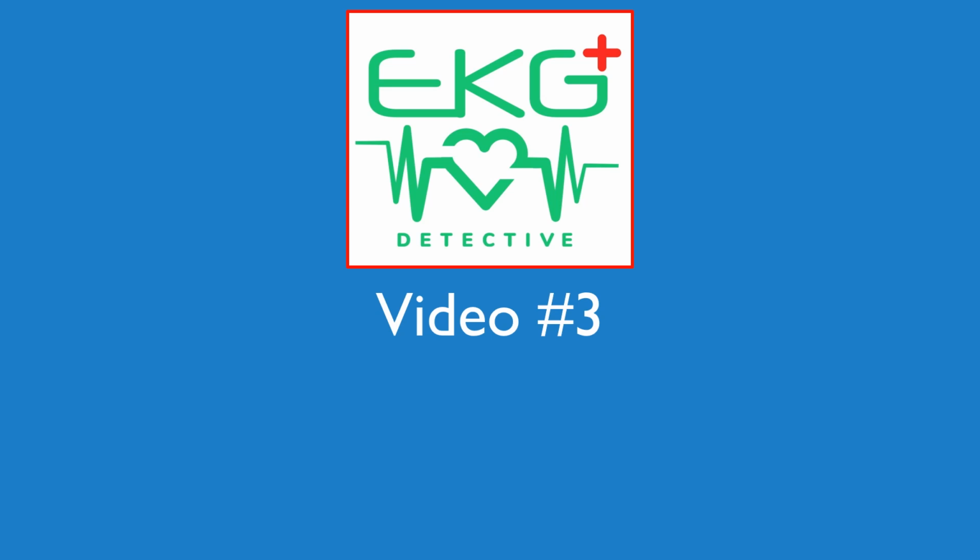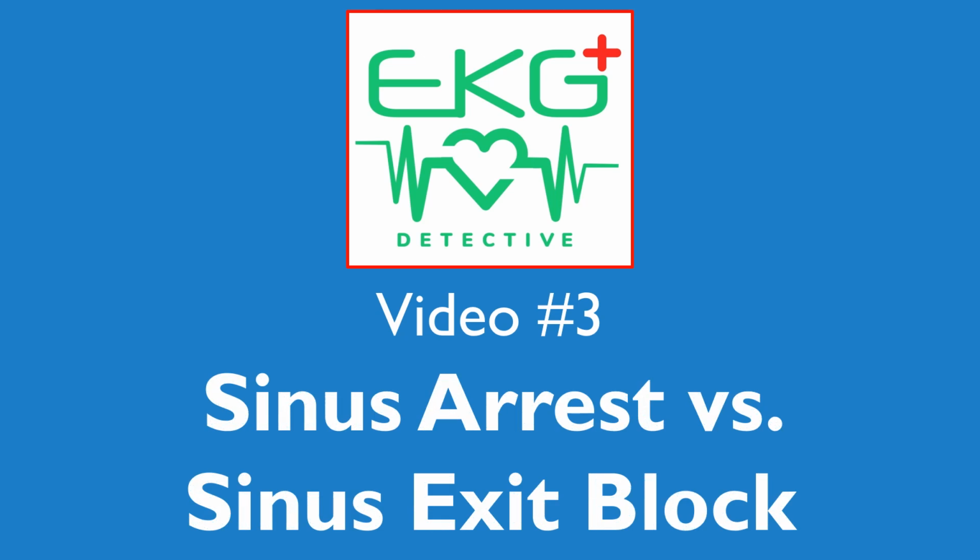Hello everyone, welcome to video 3 of the Basic EKG Detective series. This month we're going to be looking at the differences between sinus arrest and sinus exit block.